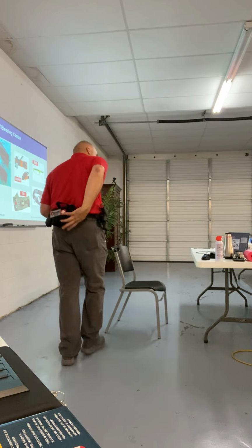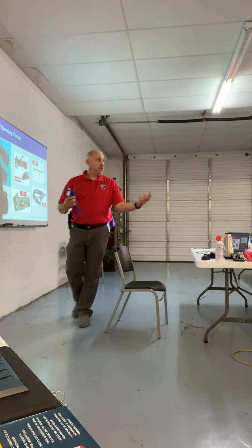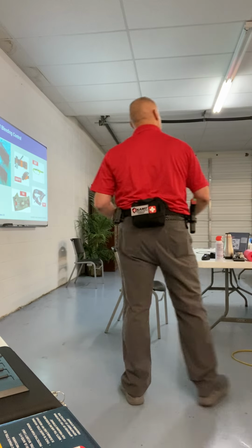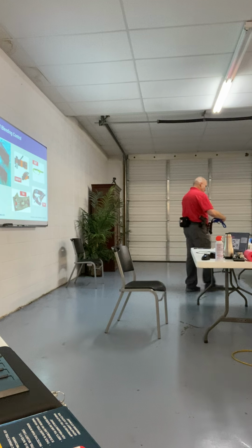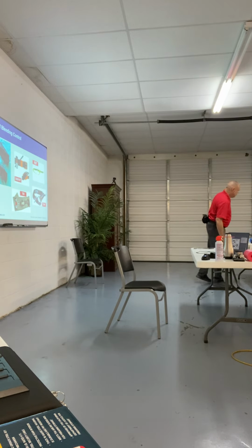Now, can I purposefully give y'all that tourniquet and let you use them? Because I want to make this point that you can buy garbage. Just like you can buy cheap guns and cheap ammo, you can buy garbage tourniquets. So tell me the difference between my black one and your black one. More substantial. This is more substantial. What else?